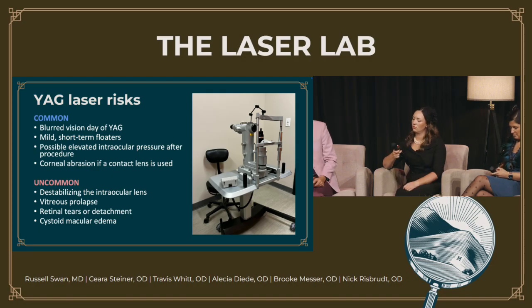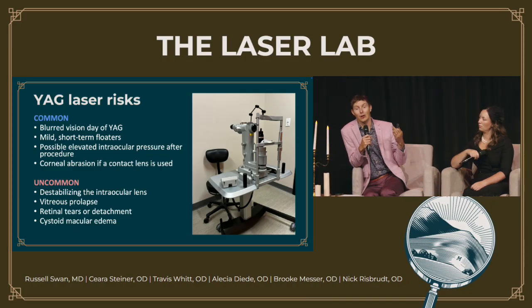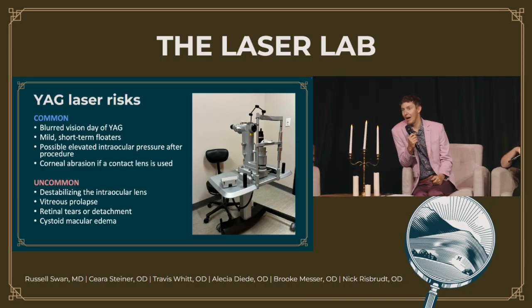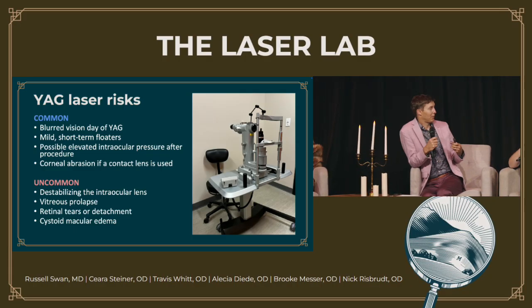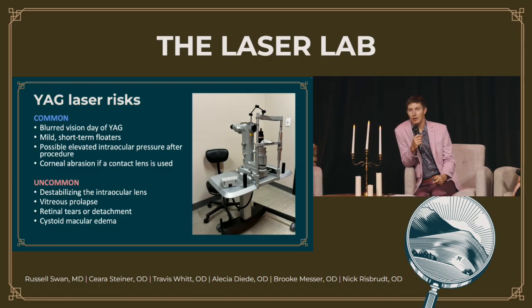Yeah, and I think, fortunately, most patients, not all patients, but most patients who are undergoing a YAG oftentimes already have a PVD. But certainly if we have an OCT and we see, gosh, this patient does not have a PVD, there is a theoretical risk there. So again, if they were to develop a new PVD, understanding those symptoms and being seen does become important.